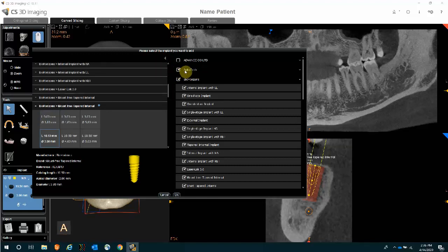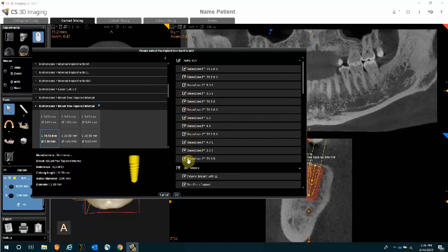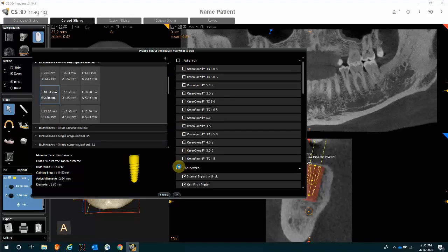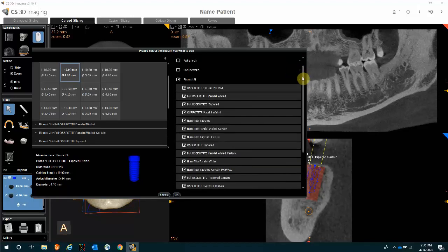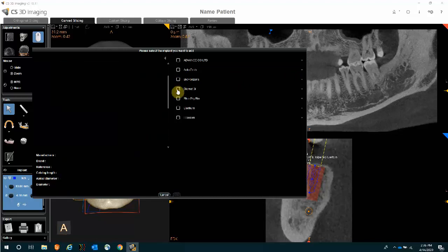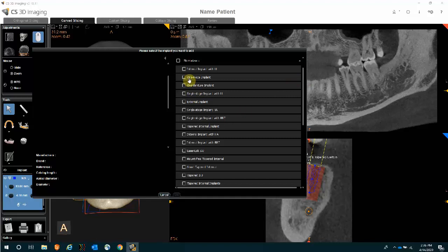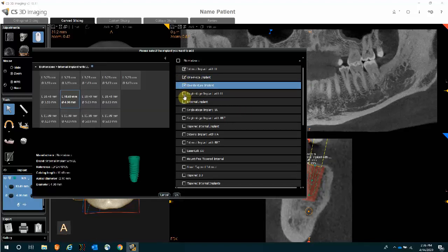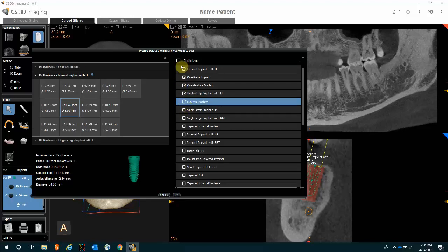As you select another manufacturer, it will select all the subcategories. To make your library look cleaner, it is generally advisable to deselect all the options first, then look for the brand of implant you'd like to use, expand on the right-hand side, and only select the particular categories or subcategories of the implant manufacturer that you actually use in your office. Then click OK.